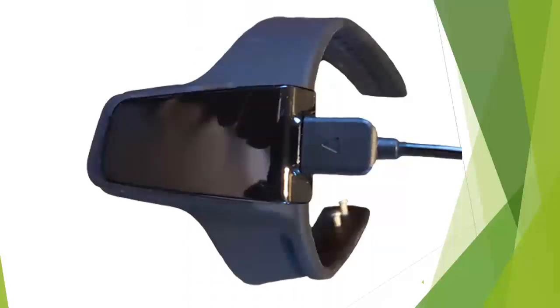To perform this test, there are a few simple steps which we will provide for you now. Your prescriber provided you with a wristwatch with the thumb sensor already plugged into the wristwatch. If the probe is not plugged in, plug it in as shown.